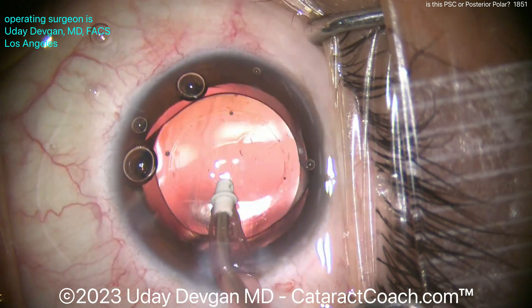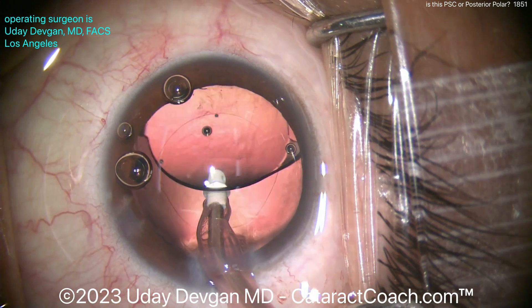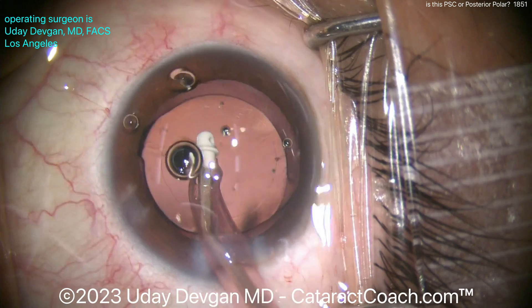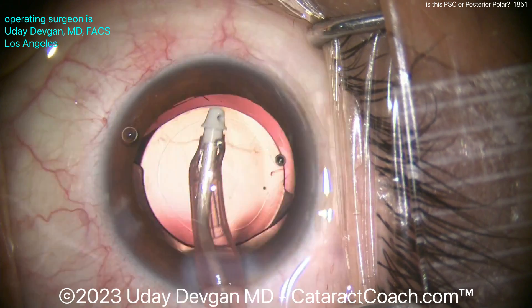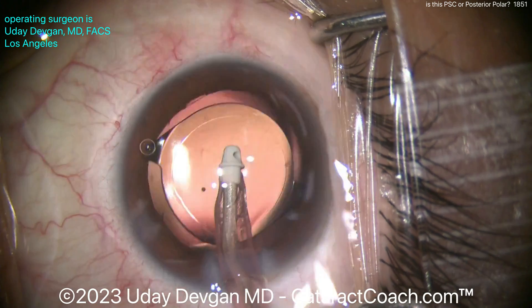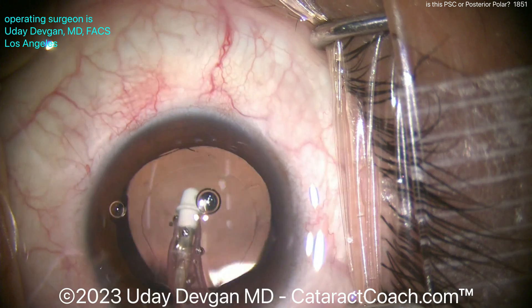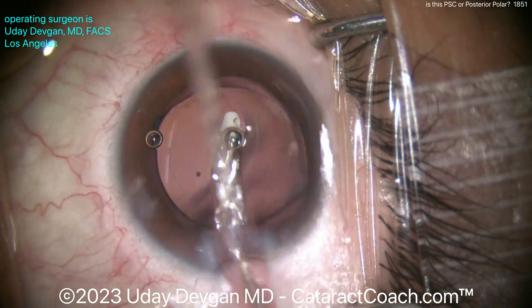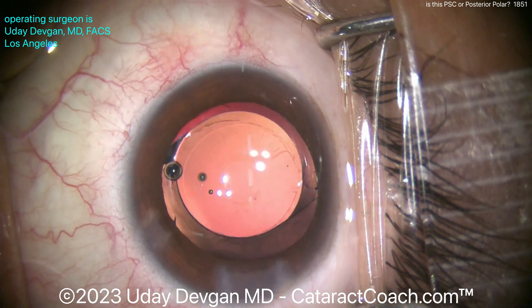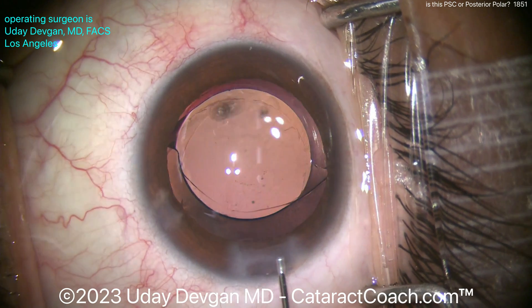That even looks like an extended depth-of-focus lens. Now going behind the optic to remove the viscoelastic — I set my parameters lower here, cutting the flow in half and the vacuum in half, because I don't want a lot of turbulence inside as I take out the viscoelastic. At the end it looks pretty clean — nice overlap, beautifully positioned lens. Coming out, I don't want the AC to collapse much; a little bit is okay. Quickly get the BSS in and hydrate this up. Not too bad.